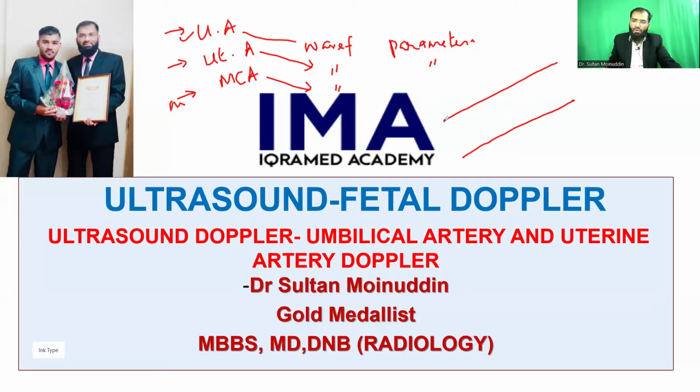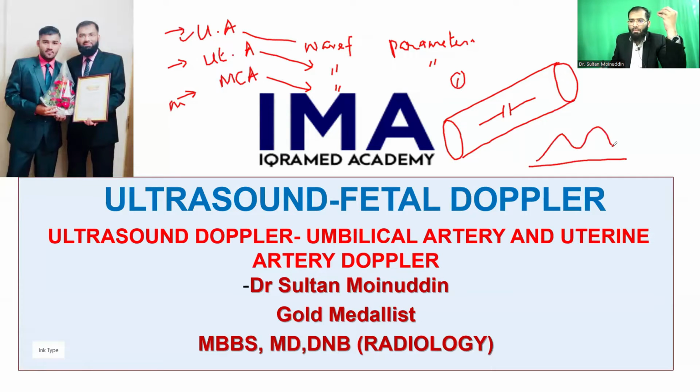When it comes to Doppler examination, the three important things of examining a patient in Doppler are: number one is the technique, that is how and where you are going to place your cursor so that you get the best waveform. Next is the waveform. So first is the technique, second is what you get, the waveform.